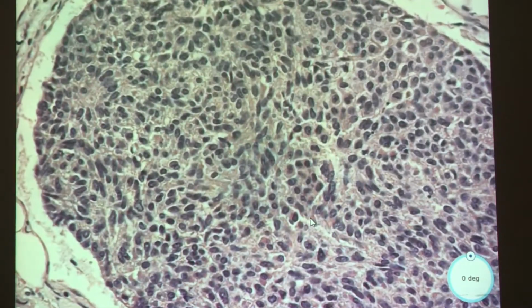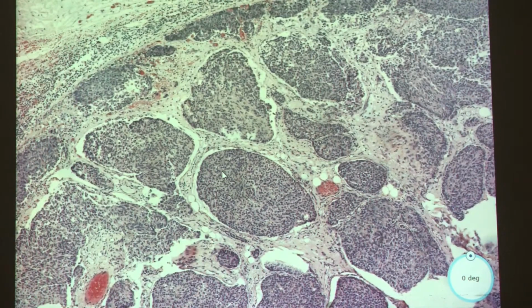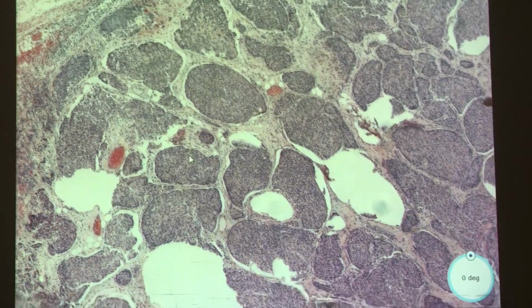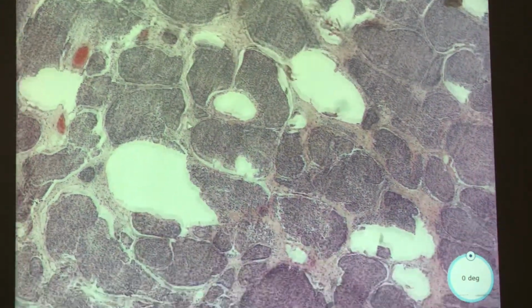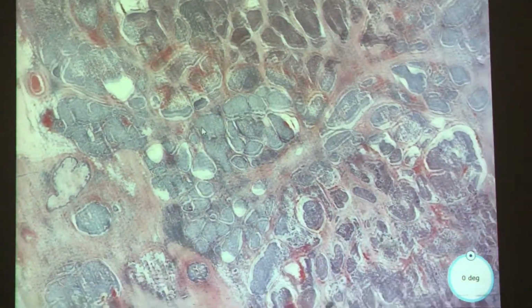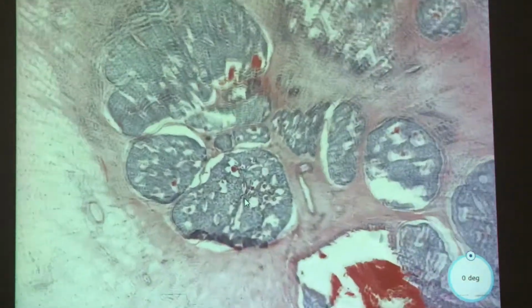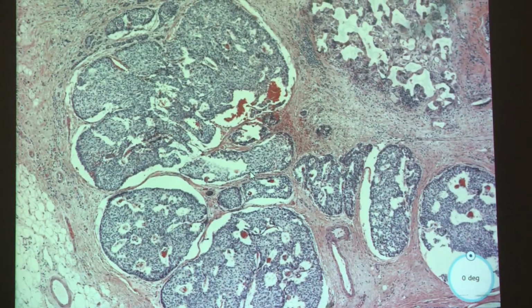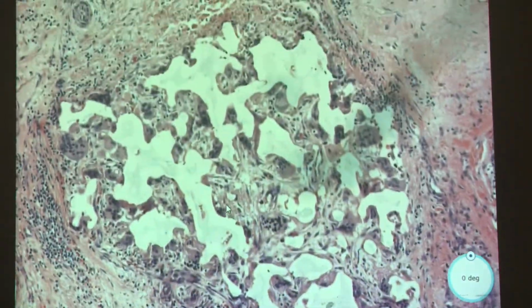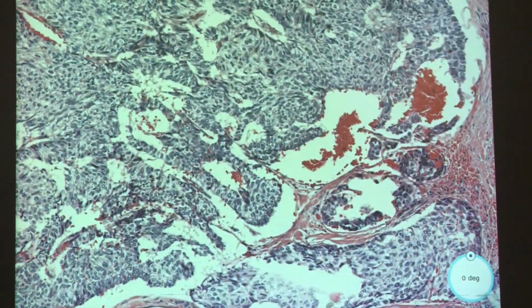It's more of a solid pattern, I would say. I don't think there is a nodular. Is there a nodular? There is not. I want you to keep looking around, because remember, we're doing papillary lesions. And this is something you asked me about before we started today. Oh, is this like a solid papillary? This totally is! But once you see the definite vessels in the middle of that solid stuff, you're like, oh yeah, these ones are better.